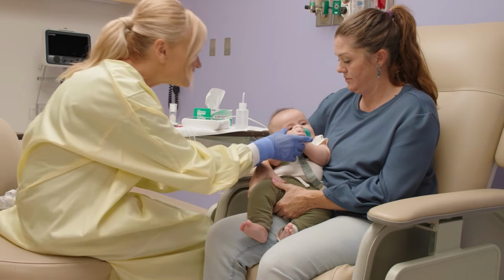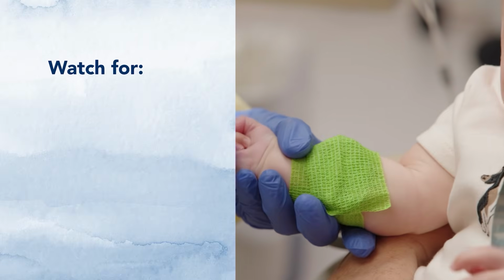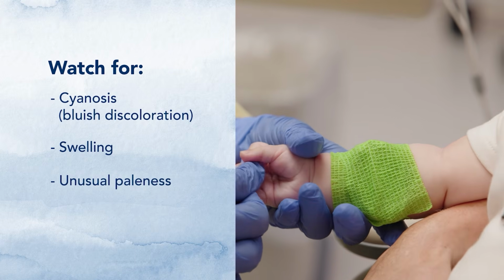As always, carefully monitor the limb for any signs of compromised blood circulation, such as cyanosis, swelling, or unusual paleness, and discontinue testing if any of these conditions occur.